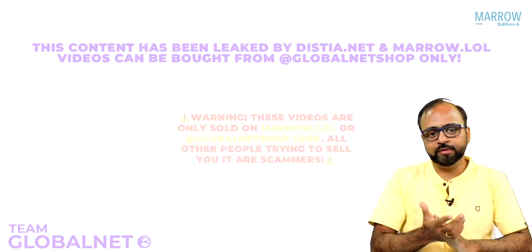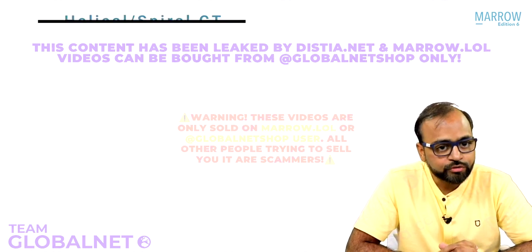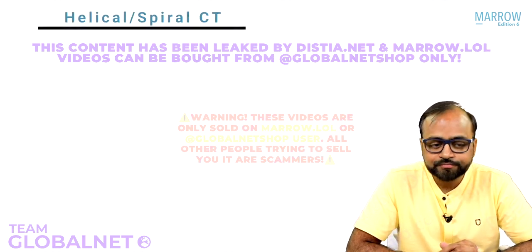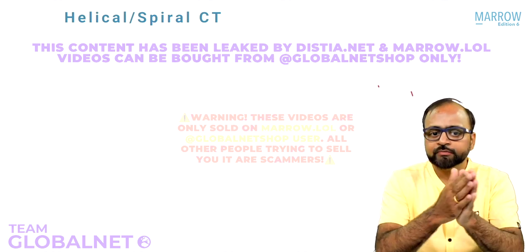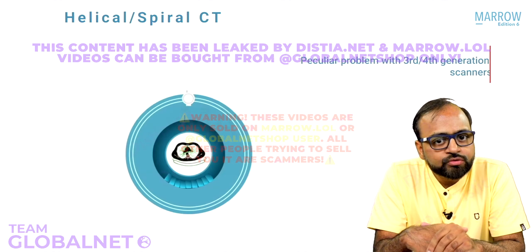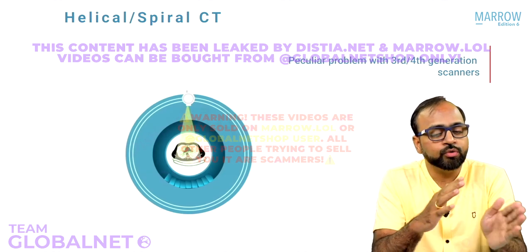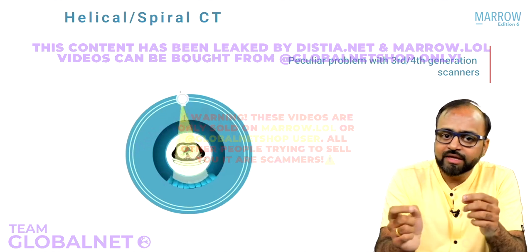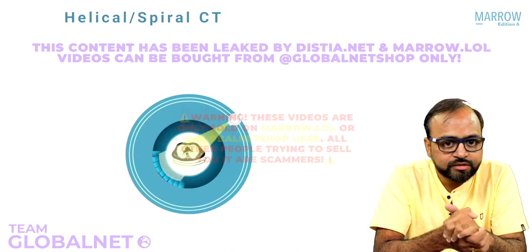There is another problem with certain CT scan machines, and therefore a new technology was introduced, that is called helical CT or spiral CT. What is this? Now just imagine, there is a peculiar problem with usually the third or fourth generation CT scanners. What is that? We know in rotate or rotate fixed that the X-ray tube has to rotate round and round around the patient's body, isn't it?